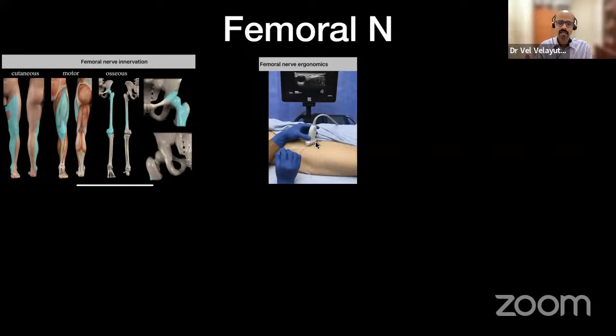if you want to get a good ultrasound picture, your ultrasound beam, which Dr. Kiran was saying, is only 1 millimeter thick. So it has to be perfectly perpendicular to the object of interest if you want to get a good picture. So if you want to see a nice round picture like that, the probe needs to be nice and straight, cutting it through a 90 degree angle, so you don't have any of the artifacts, which Dr. Kiran was saying about.